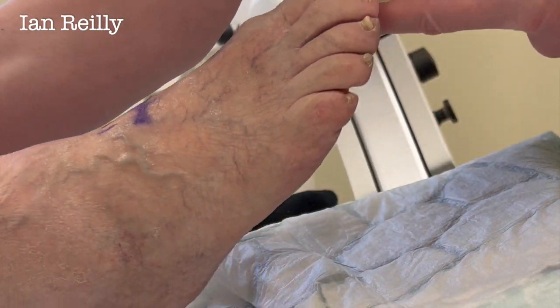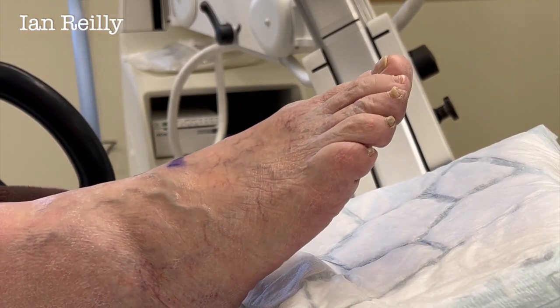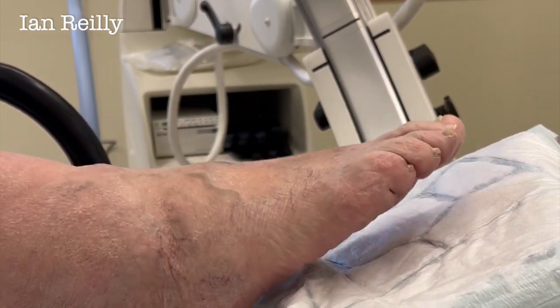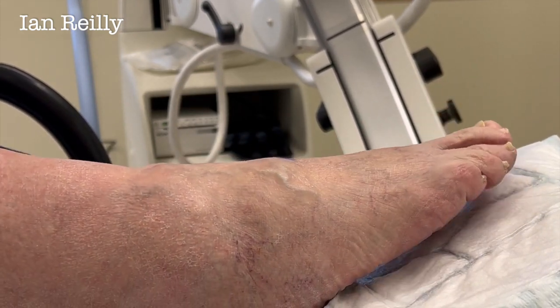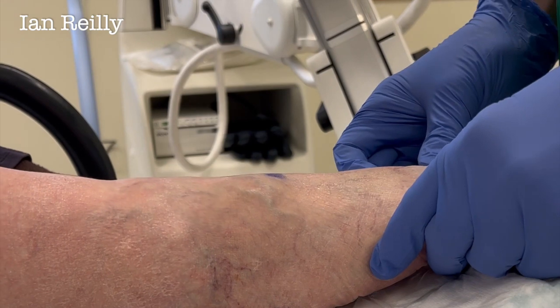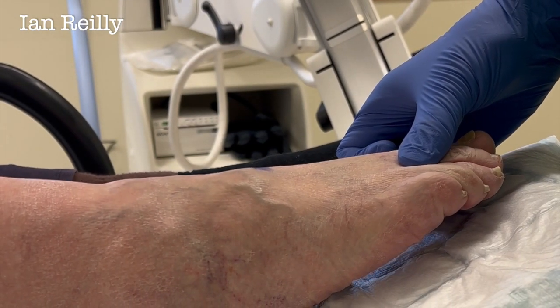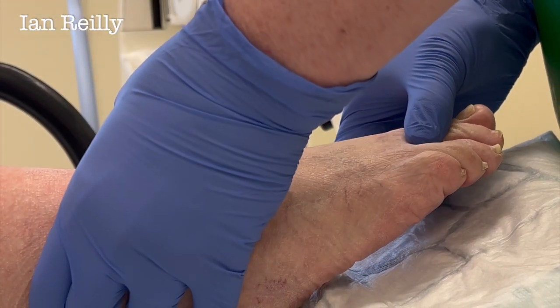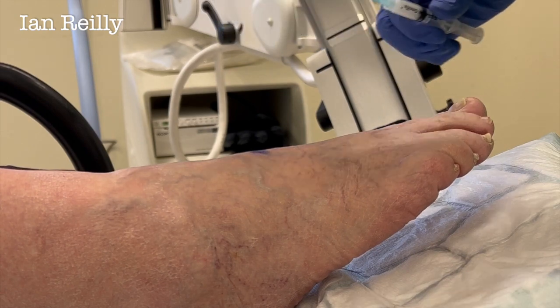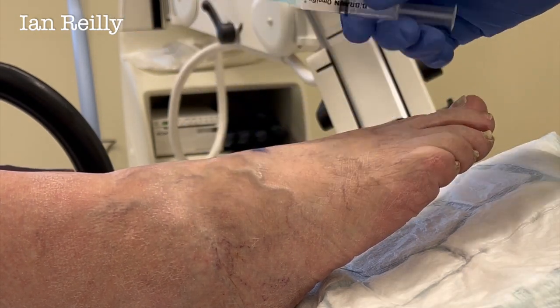Right, now I'm going to get you to bend that knee up for me. Put your foot flat and come forward a little bit — down like that, sort of thing. Loving that. Right, let's do a little check on the x-ray, Tracy, and see if we're in the right grid square. We're nearly there — brilliant, cool.